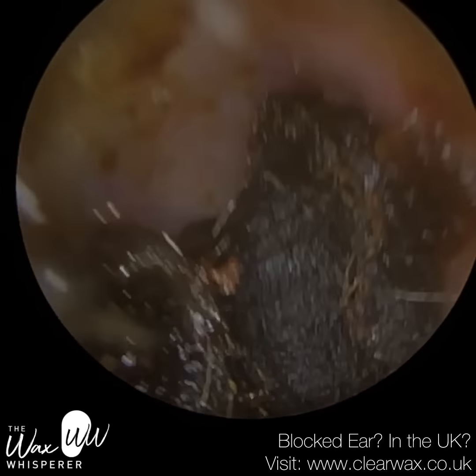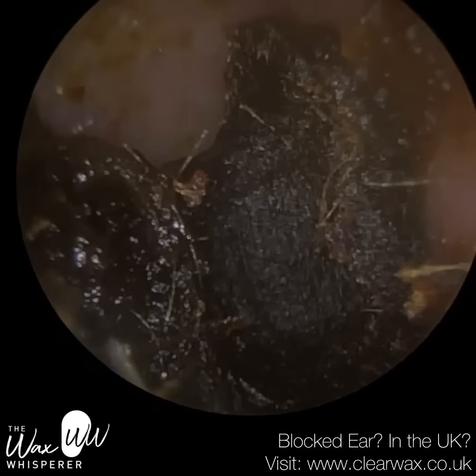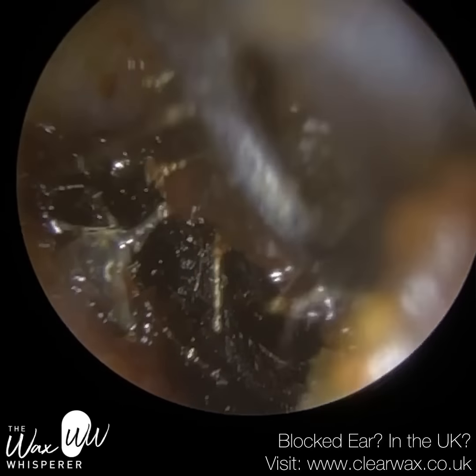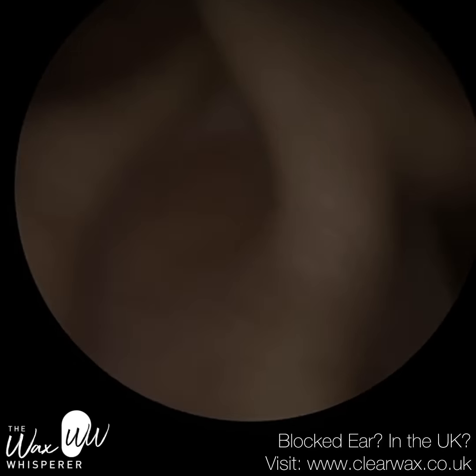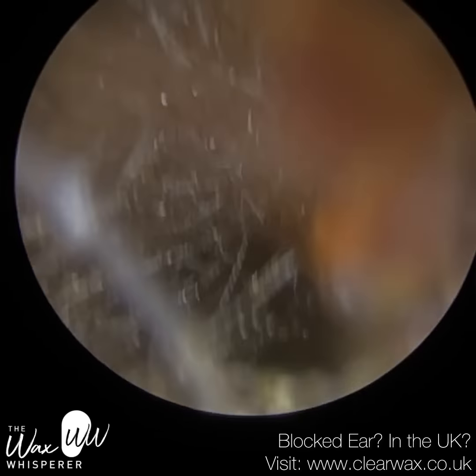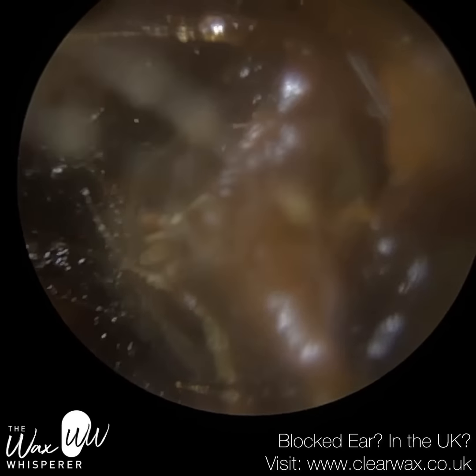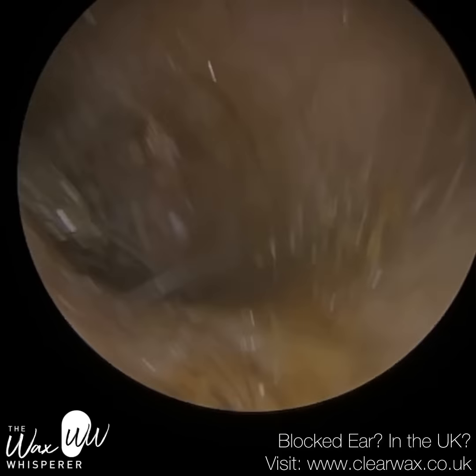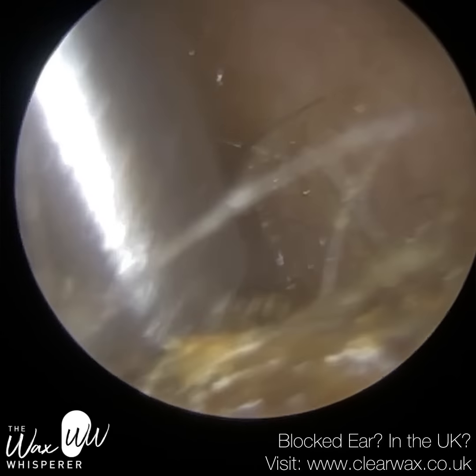We've got the more lateral wax out near the entrance. This is the posterior canal wall just past the first bend, and quite often wax can get trapped in this part. I've just gone in with the curette, scooping underneath it and separating it from the canal wall. There are a few hairs matted there — I'm just going to suction this bit away; it's just got trapped at the entrance.